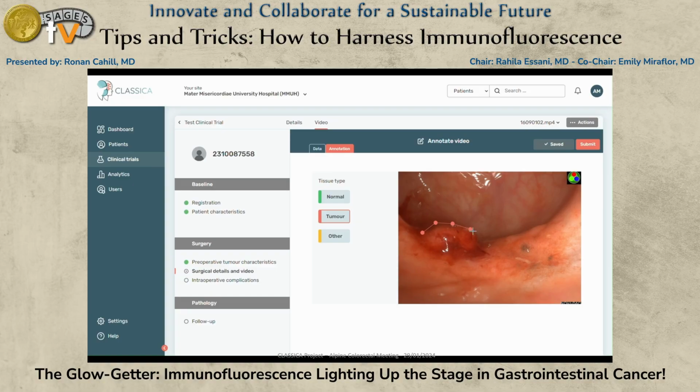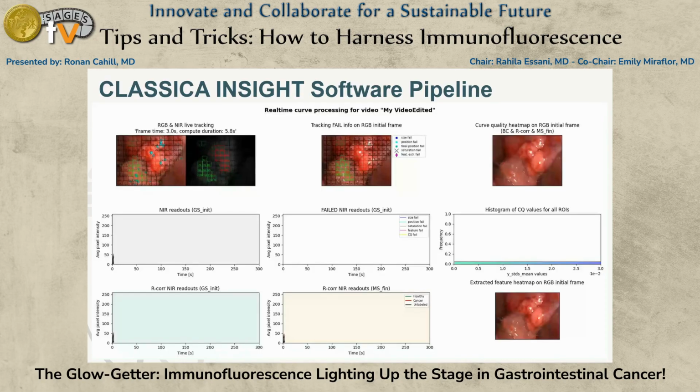So far, this is the annotation software that we're using to capture the data from the different centres coming into place. So they upload the video and some patient details, then get anonymized in the cloud, and this is how we've been doing the mathematical assumptions for it. This gives us some hint of the software performance. So when you're tracking different parts of the screen, it's important to make sure that what you're getting back is true and reliable.